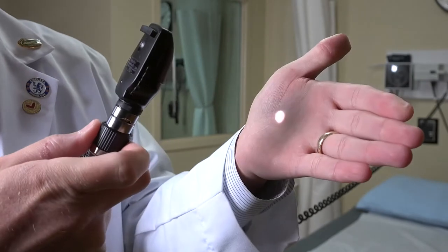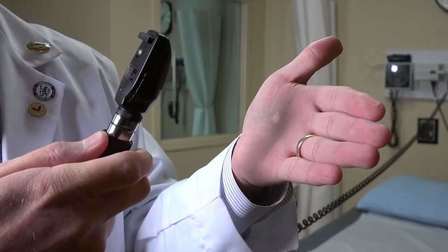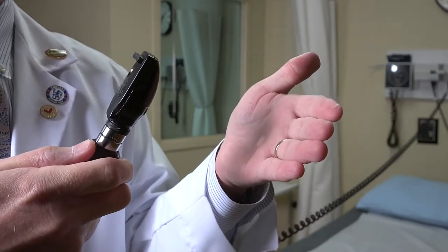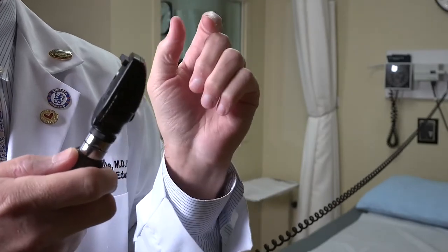When you want to look in the back of someone's eye, you want to turn the intensity down to almost the lowest it can be, just because it's a very, very bright light. You want to make sure that this is not burning the back of someone's retina while you're looking back there.